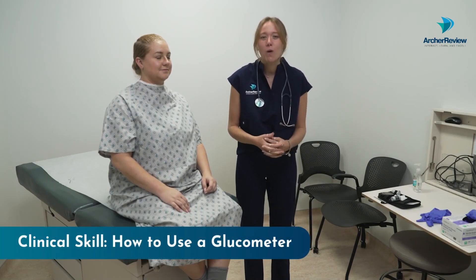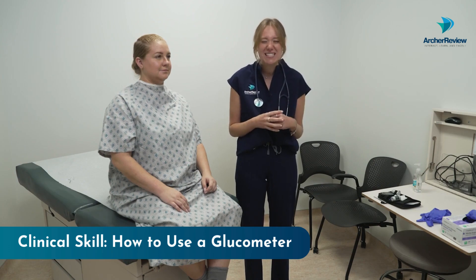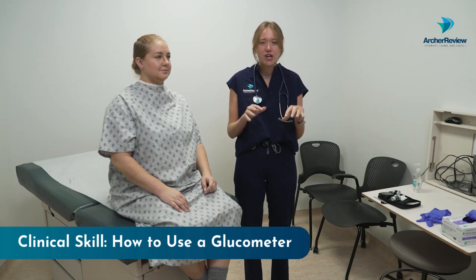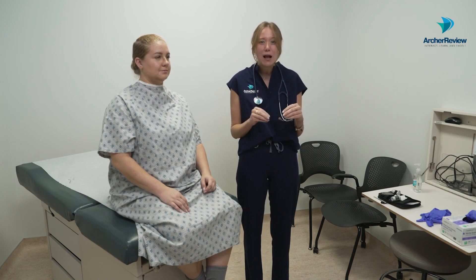Hi guys, it's Dr. Caffrey with ArchReview and welcome back to your clinical skills videos where we're going to be covering point-of-care testing, specifically glucometer checks or blood sugar checks. This is very commonly done in both an inpatient and an outpatient setting, so I want you guys to master it because we often check blood sugars on clients multiple times a day.